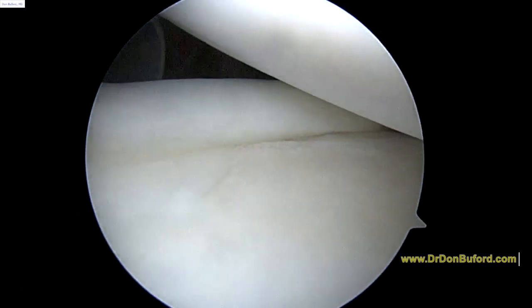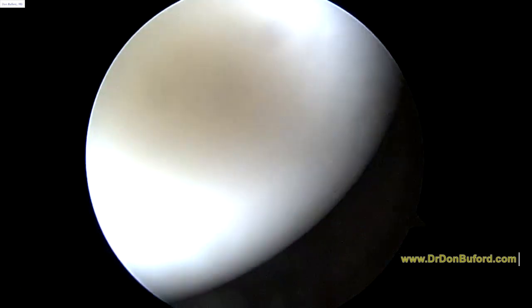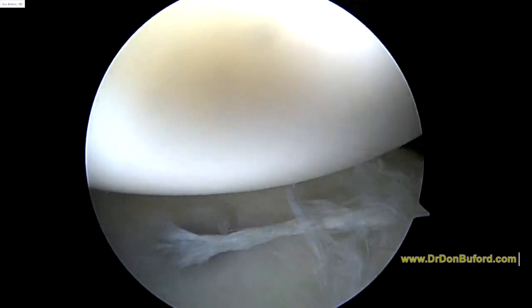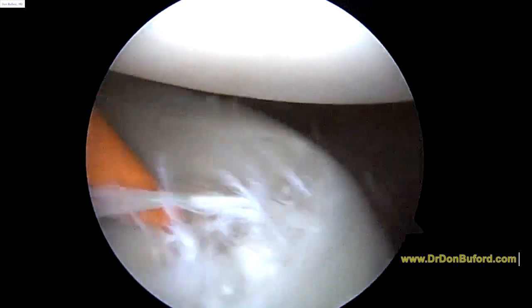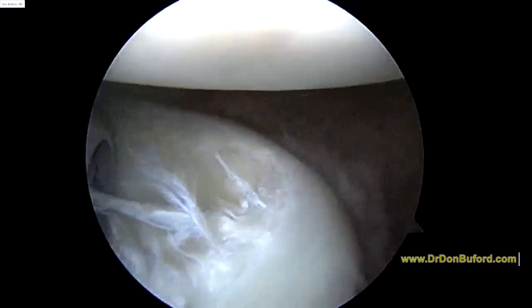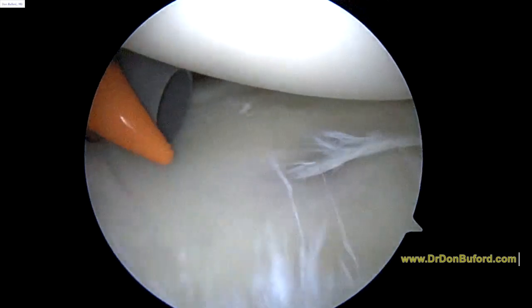And then the inferior glenohumeral ligament's going to be down below, and it's not very well defined, which again goes along with the instability that you've been experiencing. And as we look at the back of the shoulder here, we can confirm that the posterior capsule is still attached. And as we look down at the labrum, I'm guessing we're going to see some pathology, and sure enough, we can see the labral tearing here that goes along with the posterior dislocation, or these posterior dislocations you've been having. So there's the problem with the labral tearing.